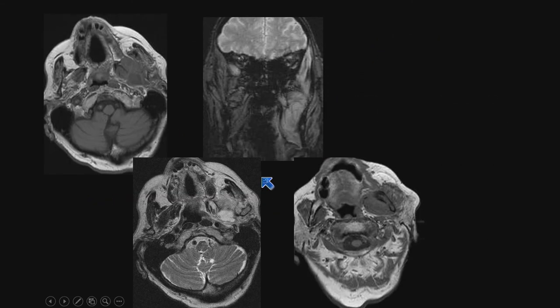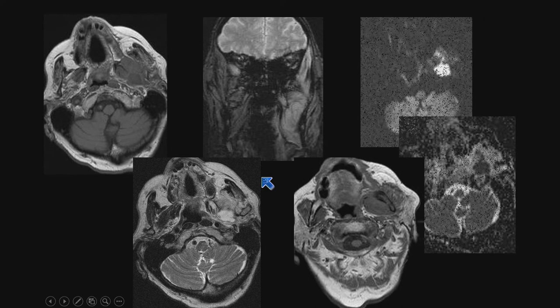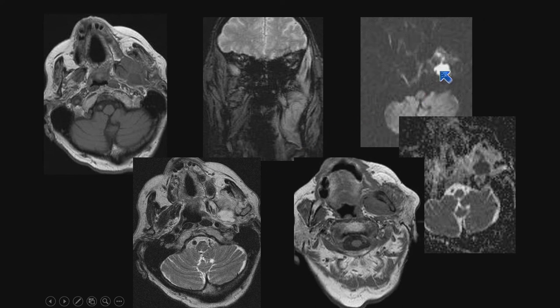Here we can see a lesion that restricts diffusion. There's the ADC map showing decreased signal, and the diffusion-weighted image showing increased signal — this is an abscess in the masticator space.